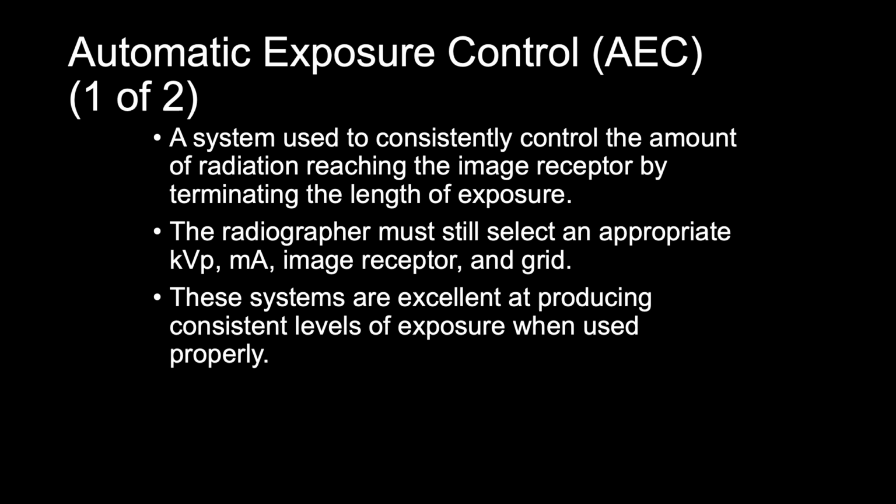So we have to make sure that we know the patient size, the patient shape, the patient habitus. We ask the patient history. And if the patient has a certain pathology, we know to either increase or decrease our technique.